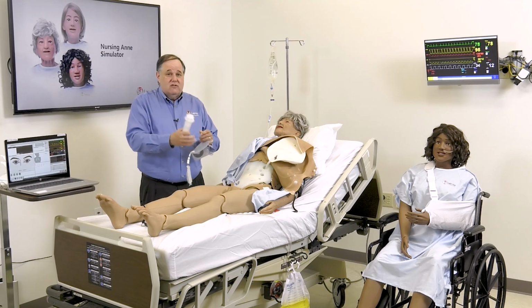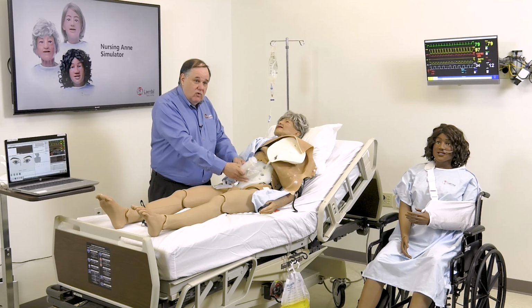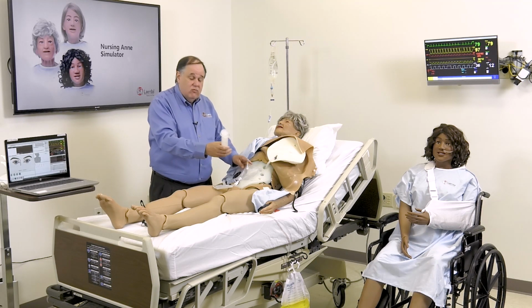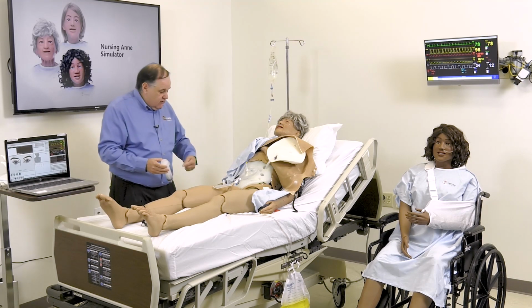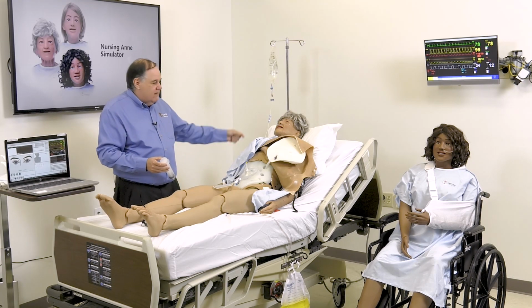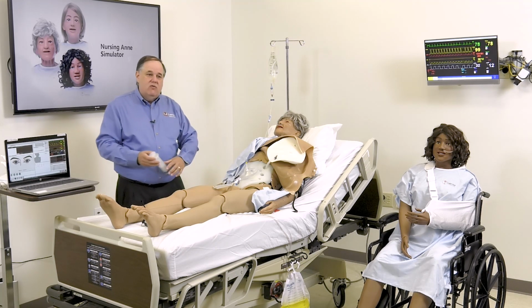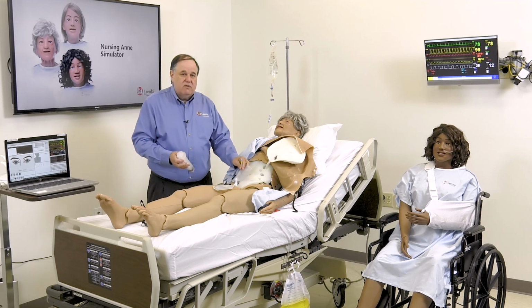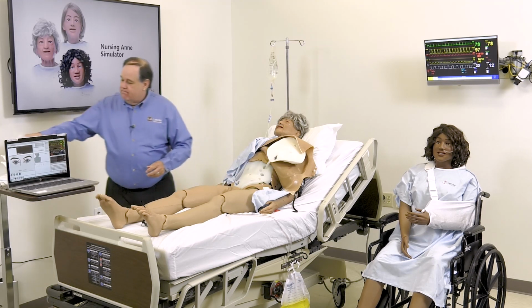So I hope that answers your question. If it's the internal reservoirs, easily through the abdominal plate for a quick recharge, and that really facilitates a quick recharge if you're doing multiple scenarios in a row. If it's about administering fluid through the mannequin via IV or central line, it comes into the mannequin and goes safely out into a receptacle bag that is sealed and allows you to recover that fluid safely.